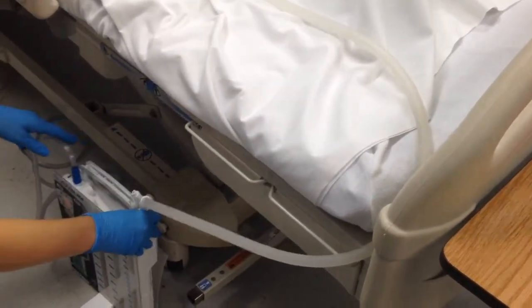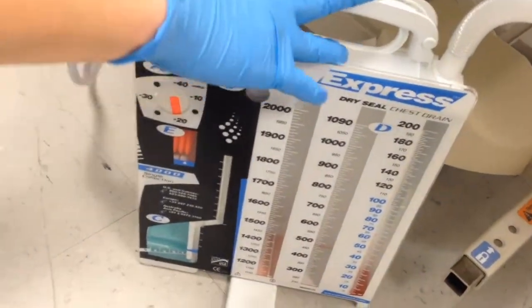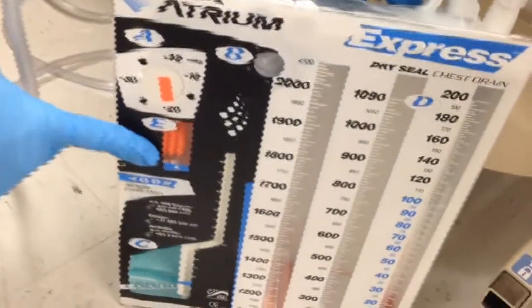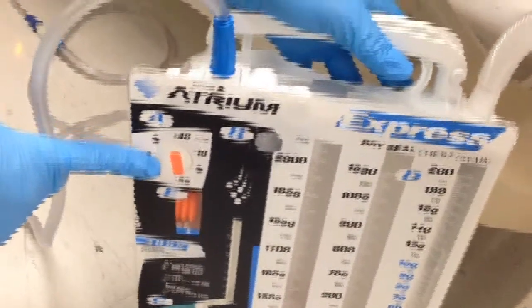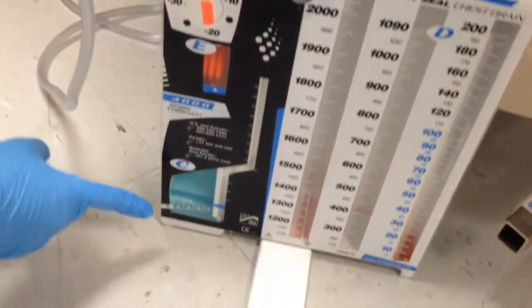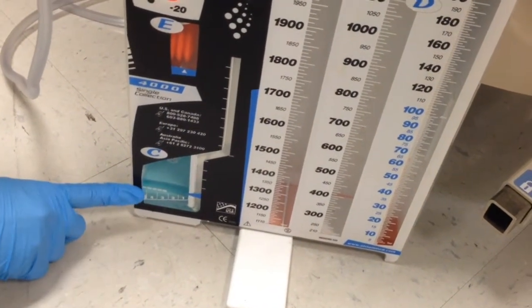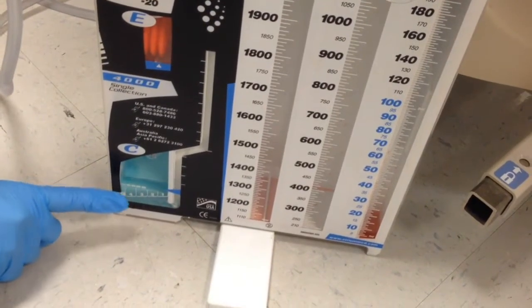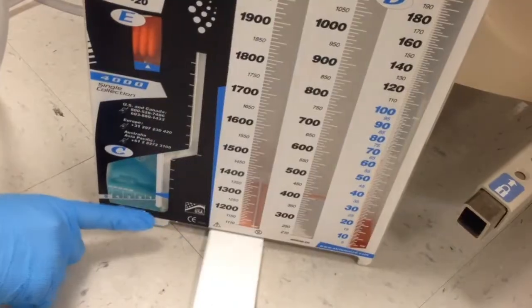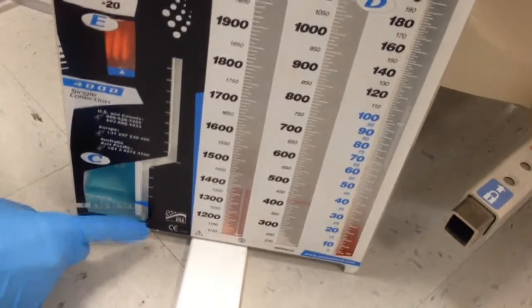We make sure the connections are good. We check the bellow to make sure suction is on and continuous. When I remove suction the bellow disappears; when I reconnect suction the bellow reappears. This is the pressure it's set to — done by physician orders only. Next we check the water chamber to make sure the water level is equal to the 2 cm mark. If it's not, we need to add or remove water. You check for bubbling — we don't want bubbling, as bubbling means there's a problem with the connection. With each breath you will see a rise and fall of the water level, and this little ball will rise and fall with each breath.